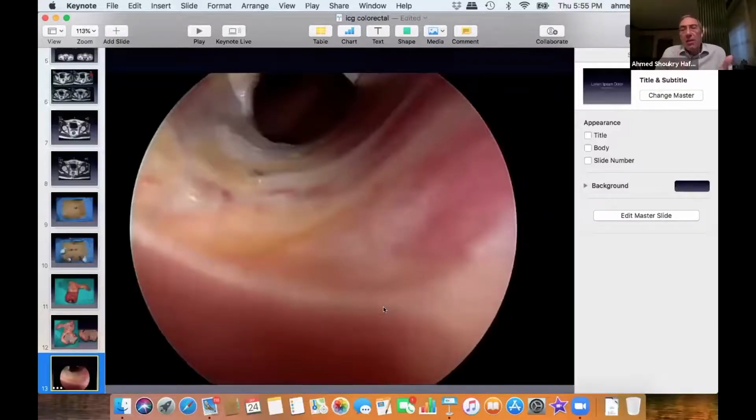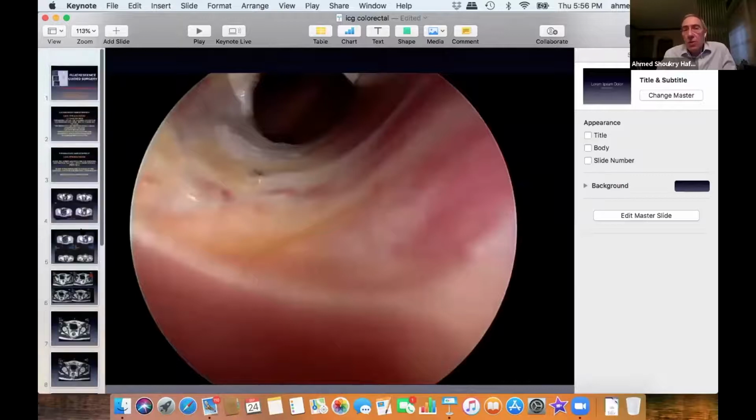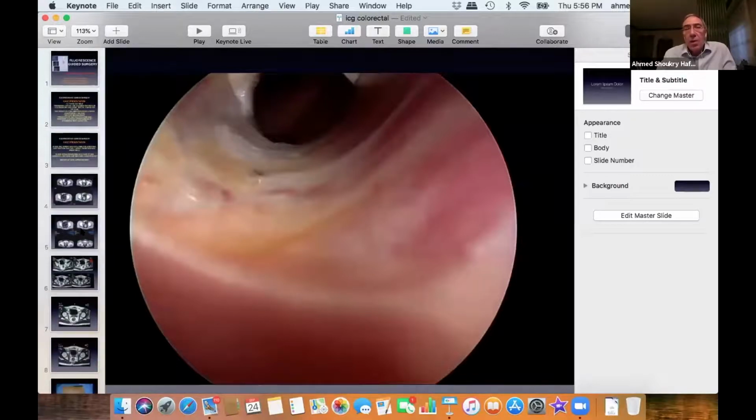Patient had many previous surgeries unknown to us. Some of them involved bowel resections, and he had lymphoma as well. So ensuring good blood supply and documenting it with ICG was very important for us. And I hope this gives you a clue that ICG can be a very strong element in your practice if you're doing these kinds of complex cases.